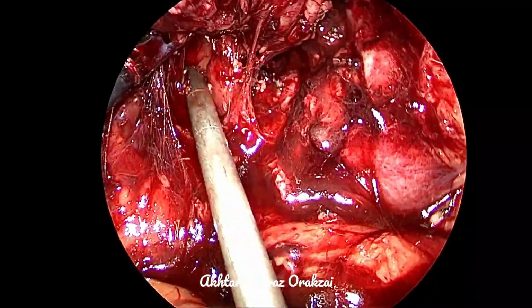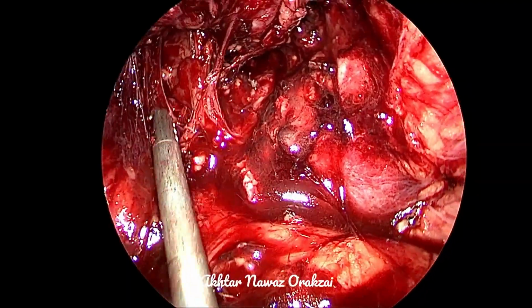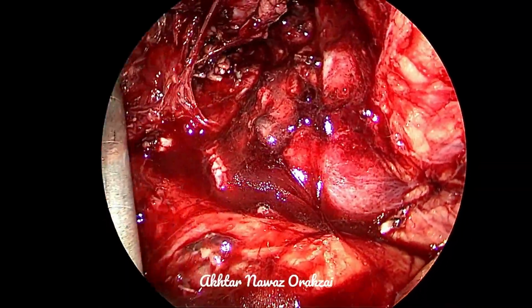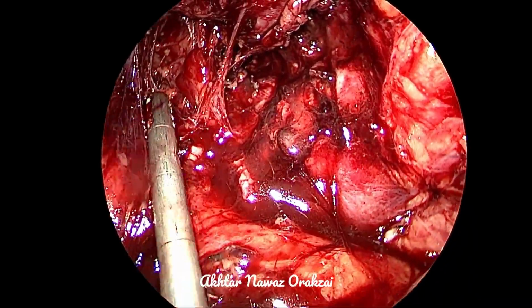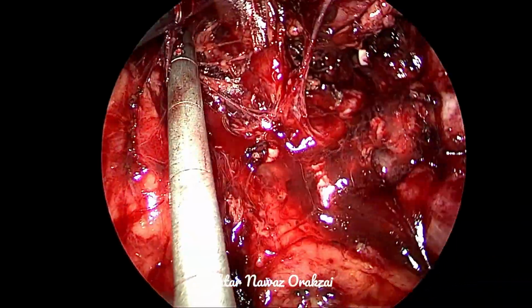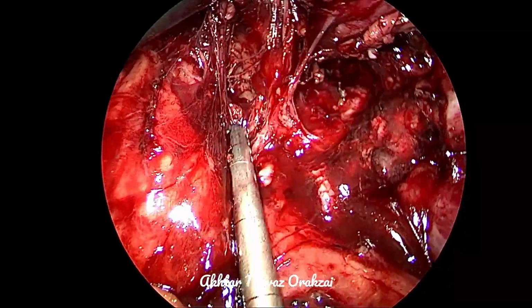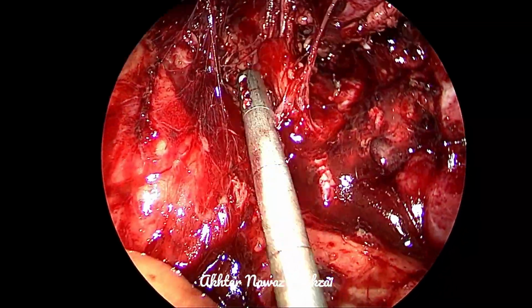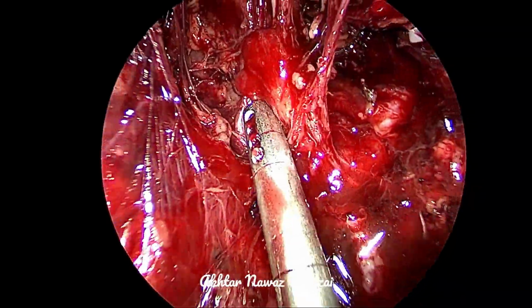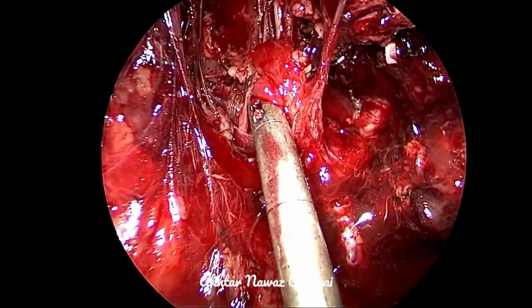and you can see a lymph node. So the lymph node is a sign that the artery will be around here somewhere, and there are some very small vessels coming and going from aorta. Some of them are lymphatic, some of them are small venous channels, some of them are small arterial channels, but we are looking for a bigger artery.